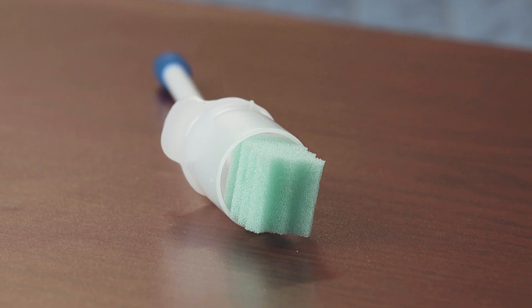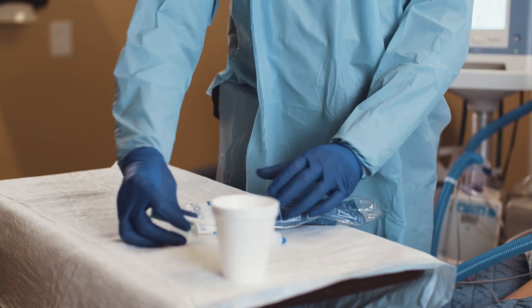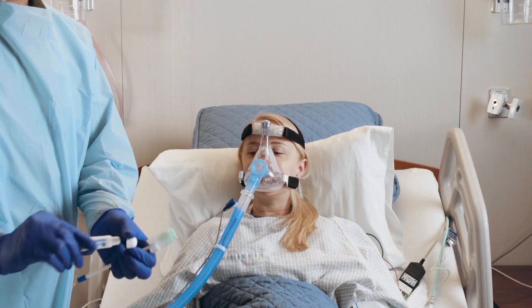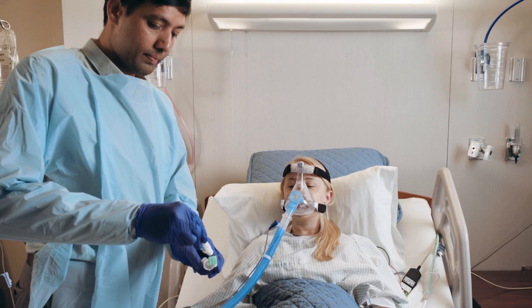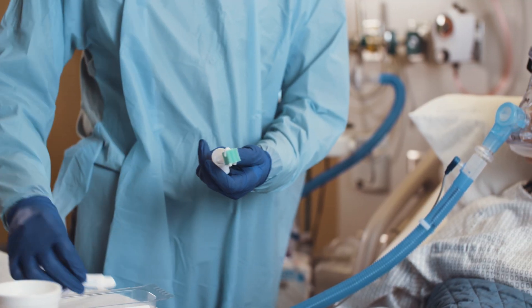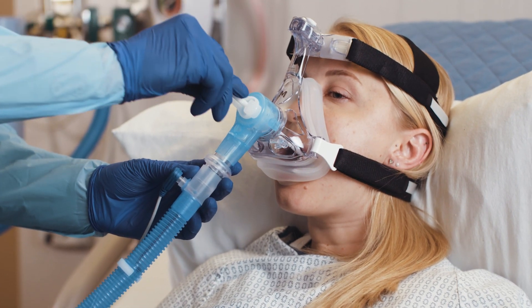Locate the applicator swab included in both the suction swab pack and the suction toothbrush pack. This will be used to moisten the patient's mouth with ice water or mouth moisturizer gel. Apply ice water or mouth moisturizer to the sponge by retracting the protective guard and dipping the sponge into ice water or applying moisturizer to the outside of the swab. Ensure the moisturizer gel does not get on the outside of the protective guard. Apply water or mouth moisturizer to the mouth and lips as needed.